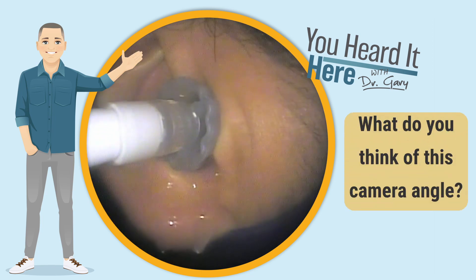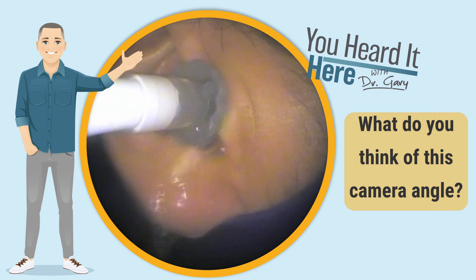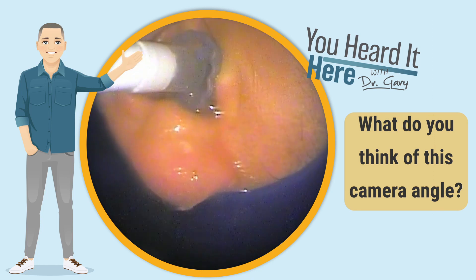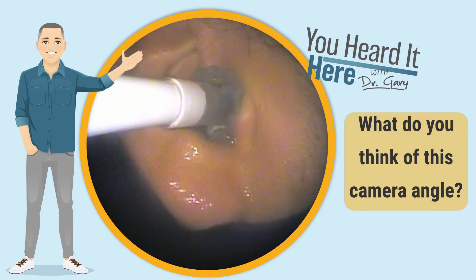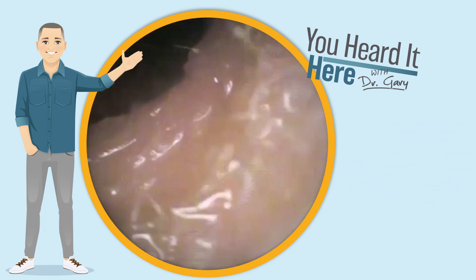Now we're going to try this camera angle. You can see we're using the water irrigation system, and you can see the water coming out of the patient's ear. We're not seeing any large chunks here, but the water is a little bit discolored as it's coming out. You're going to see when we put the video otoscope back in the ear that the wax has significantly changed colors and definitely moved quite a bit.